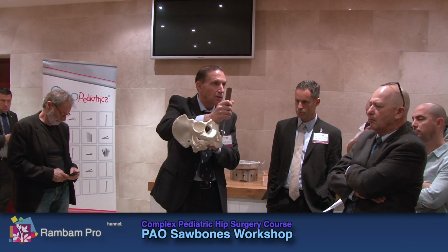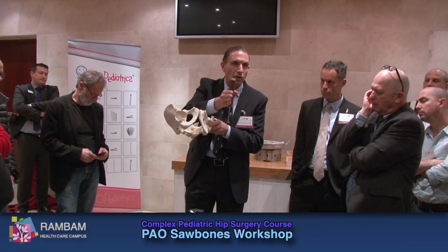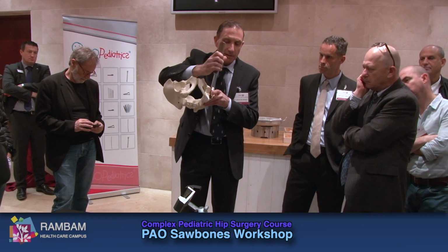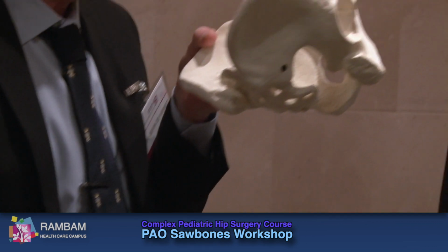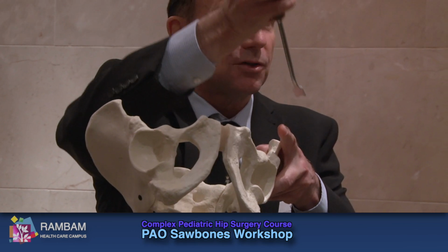At this point in time, we start to go to the back here, at the hip, you want to externally rotate and abduct to take the sciatic nerve away from your osteotome. And you'll find that if you try and push your osteotome outside the bone down here, it stops. That's because of the attachment of the hamstring, right? So you know that's far enough. This bone down here, if you look at it, is triangular in shape. So your osteotome is to go here, here, and here in a triangular shape.